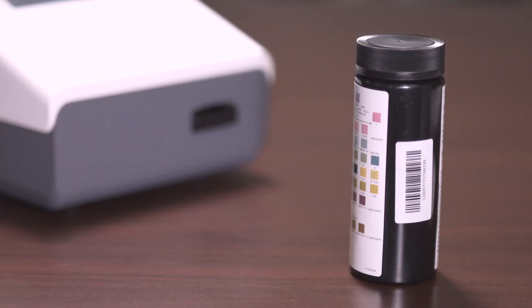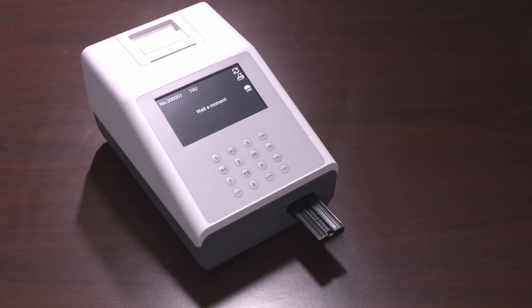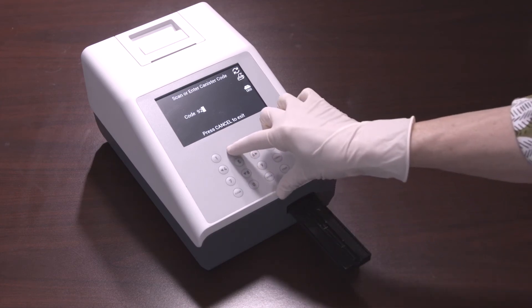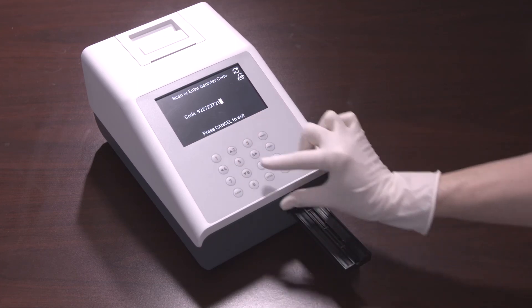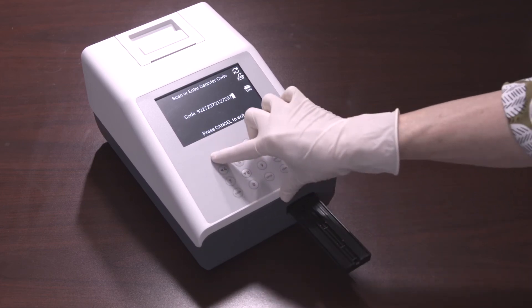When using a new canister of strips, the analyzer will request that a canister code is entered from the new canister. The code can be entered manually from the keypad or scanned from the barcode reader if installed. At first startup, the strip holder will fully extend and the screen will prompt you to scan or enter the canister code. Scan or manually enter the canister code from the strip canister. If the canister code is correct, the analyzer will go directly to the test screen. If you press Cancel, the analyzer will return to the initial screen.